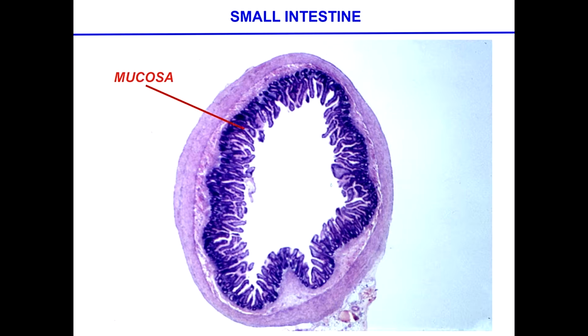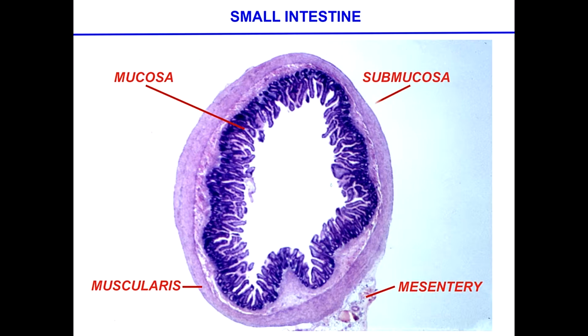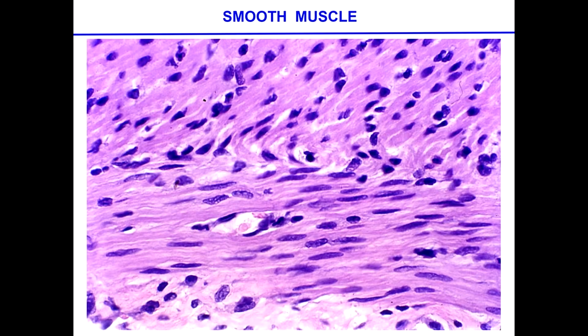All right. So that's now the different portions with the proper names that we will look at later when we look at the GI by itself. Smooth muscle, and this is one portion which is longitudinal, this one here. And these are transversal sections. So the way the preparation has ended up is showing you in the same slide both of them. And at the very bottom, there is a mixing with the connective tissue. Questions?